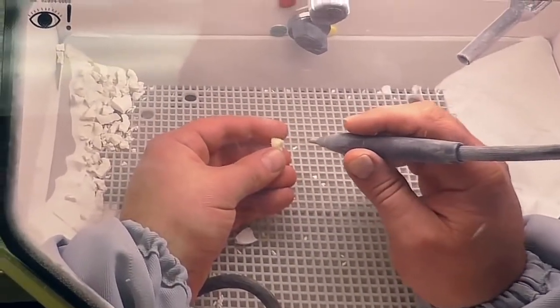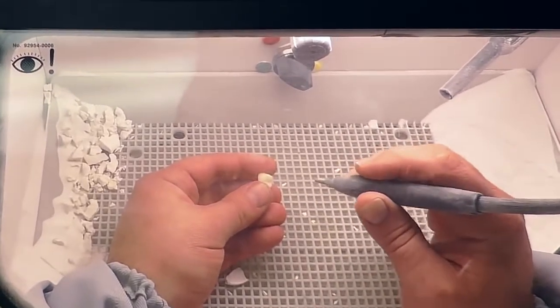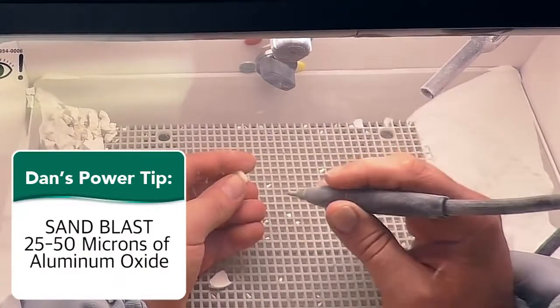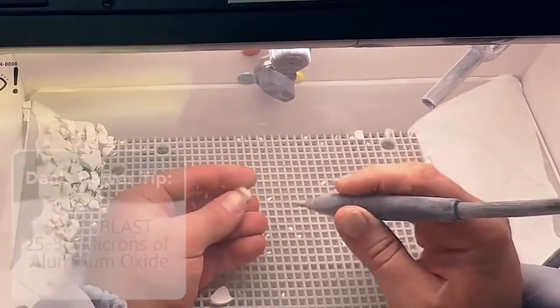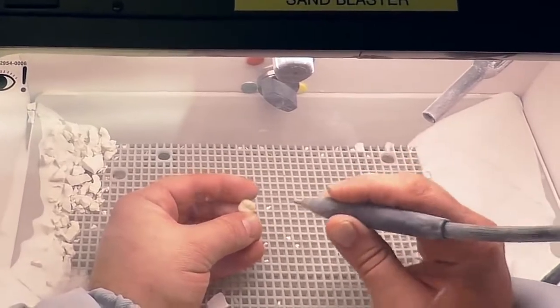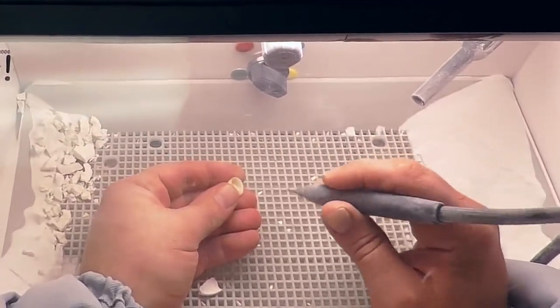Now we want to take the Sarismart restoration and lightly sandblast it with 25 to 50 microns of aluminum oxide, staying away from the margins, going over the surface, and also the intaglio.